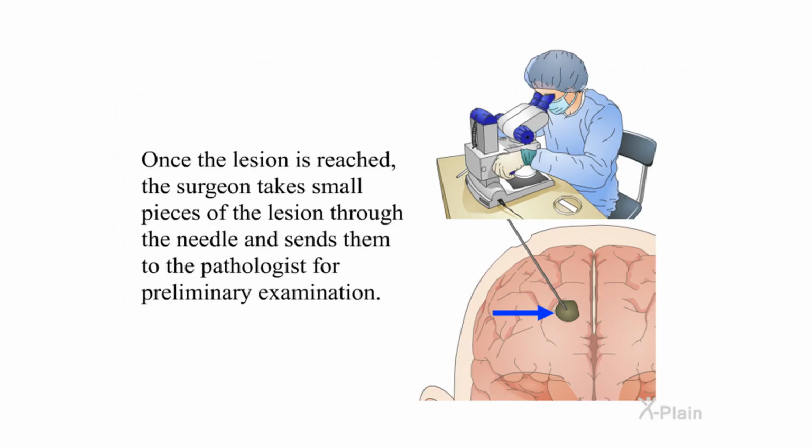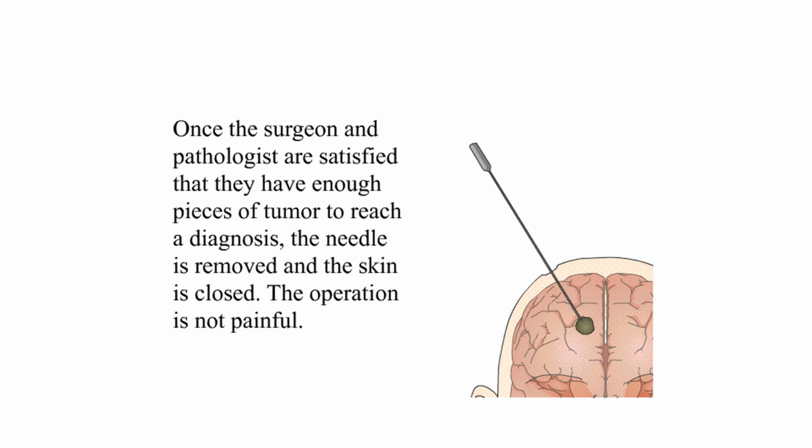Once the lesion is reached, the surgeon takes small pieces of the lesion through the needle and sends them to the pathologist for preliminary examination. Once the surgeon and pathologist are satisfied that they have enough pieces of tumor to reach a diagnosis, the needle is removed and the skin is closed. The operation is not painful.